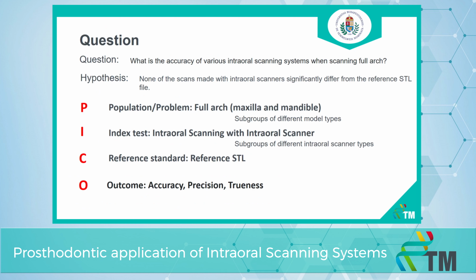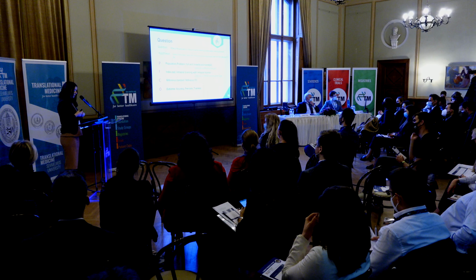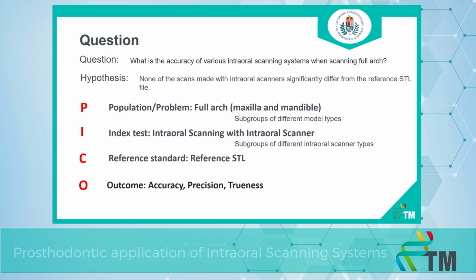none of the scans made with these intraoral scanners can significantly differ from the reference STL files made with the reference scanners. So the outcome should be the accuracy, and the intervention that we are watching is the intraoral scanning systems. And the reference is always a reference scanner, and we want to compare it with the reference STL file in full arch cases, which means that we want to check the maxillary and the mandibular arch.